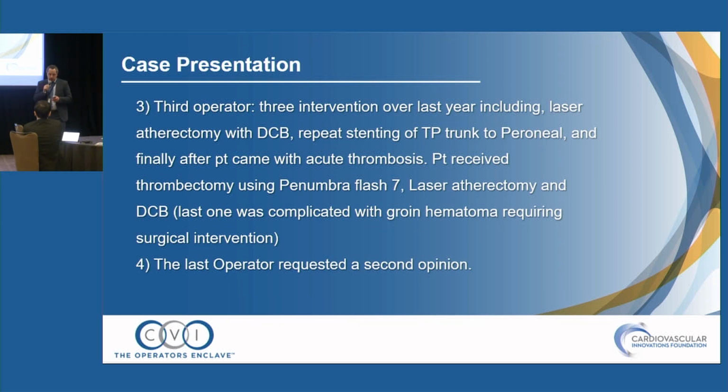So the third operator, when this happened, now he has a flow. The flow goes to a peroneal that ends halfway in the leg. There's really no good outflow in that vessel, and when we reviewed the case, we think that's why these arteries continue to close, plus the multi-layer stent.